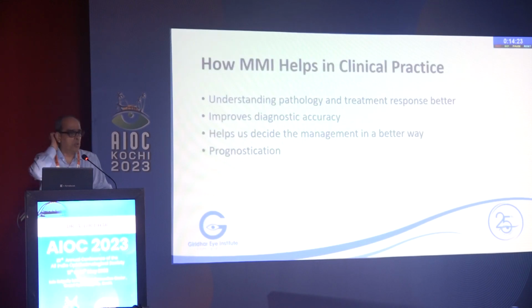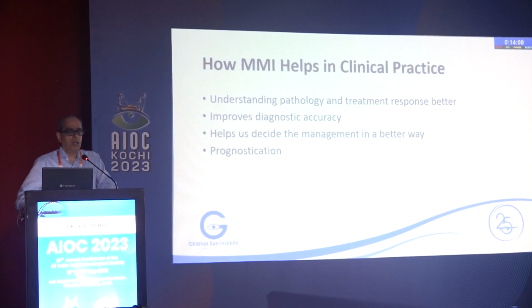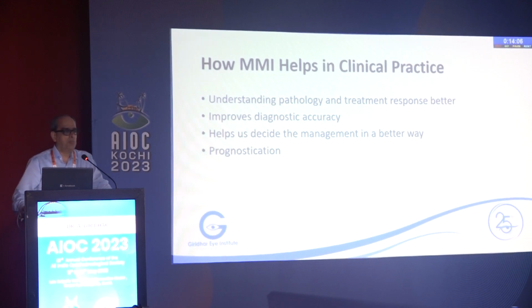Anyway, what I'm going to do in the next 10 to 15 minutes, you can stop me if I'm crossing the time, is basically to make you all understand how we can apply multimodal imaging in retina practice. Multimodal imaging today has become an essential tool in the diagnosis, prognostication, and management of many macular diseases. And basically, what is multimodal imaging?